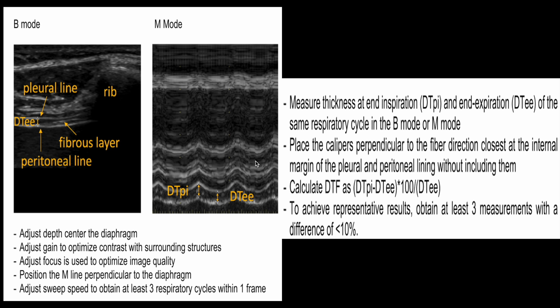Measure the thickness of the diaphragm at end inspiration and end expiration within the same respiratory cycle. Place the calipers perpendicular to the fibers at the internal margin of the pleural and peritoneal lining without including them — include only the muscle, not the pleural lines, as shown here.